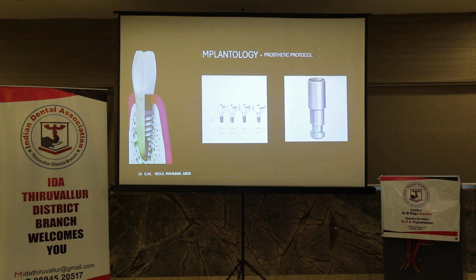Next one is analog. Analog is nothing but a dummy implant. The implant we place intraorally, we need something in the cast, right? So that is a replica, a dummy implant. The implant is inside, and only then can we do the processes on top of it. So that is analog, also known as a dummy implant.